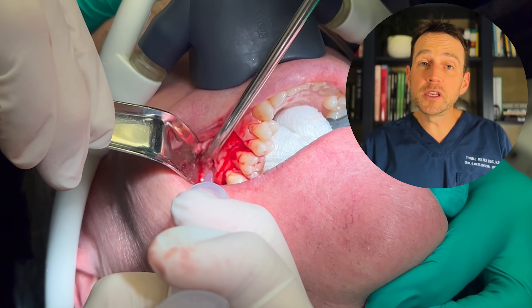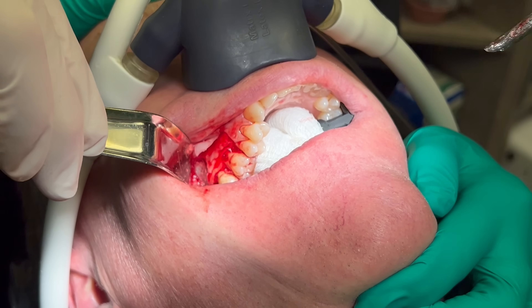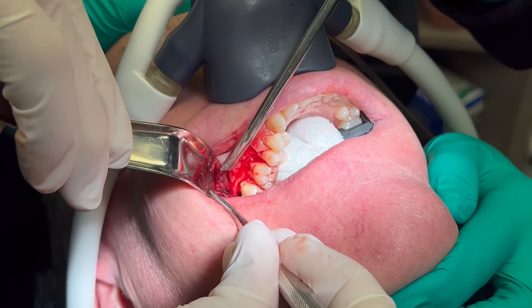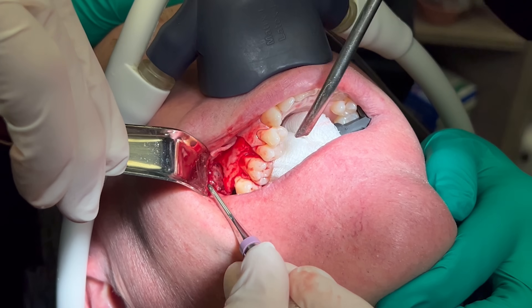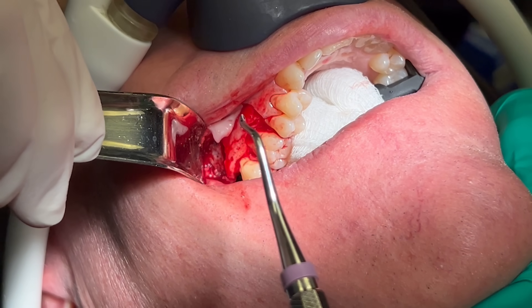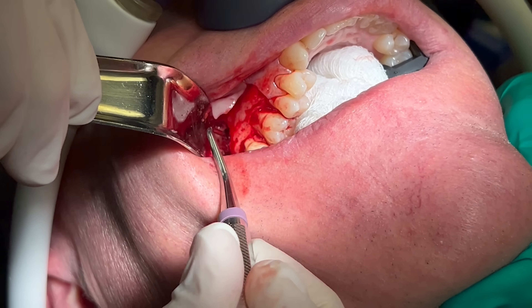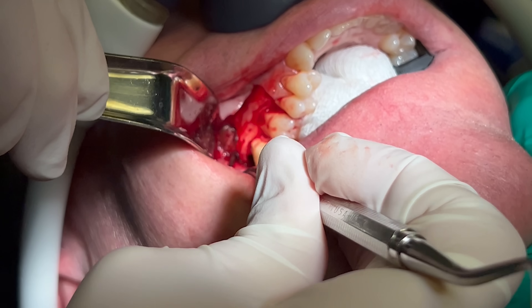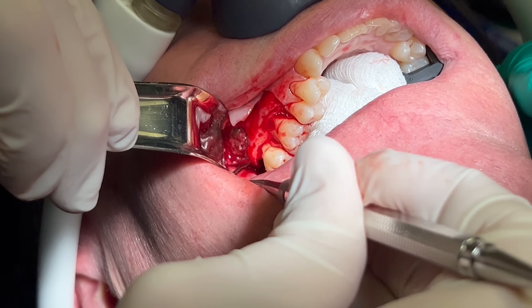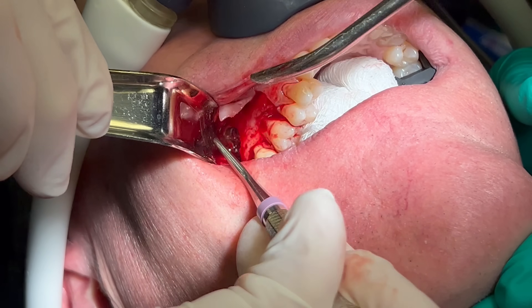Here is the lining of the lesion coming into view. I remove a small portion of the lining to visualize the impacted tooth.